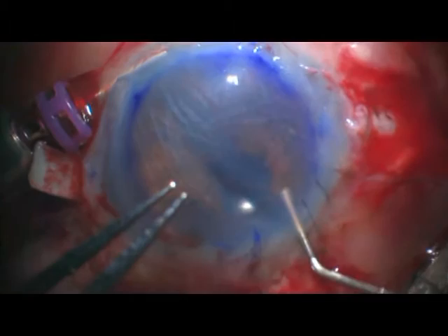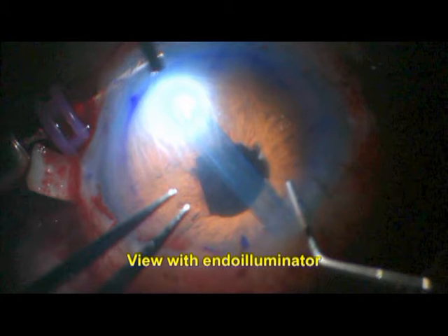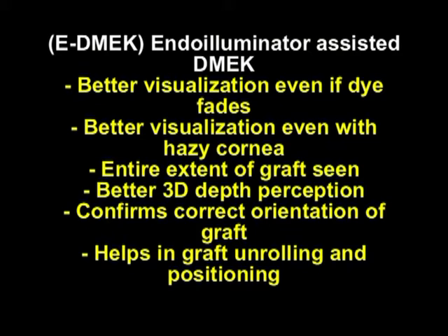This is the standard vitreoretinal light pipe that is used by vitreoretinal surgeons. EDMEK has advantages in that it provides better visualization even if the dye fades, and it provides good visualization even through a hazy cornea.